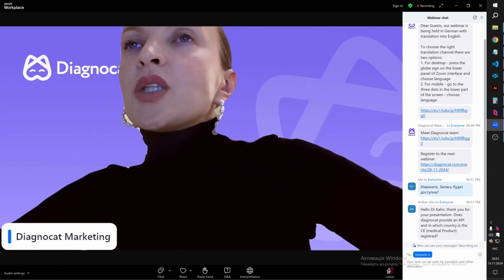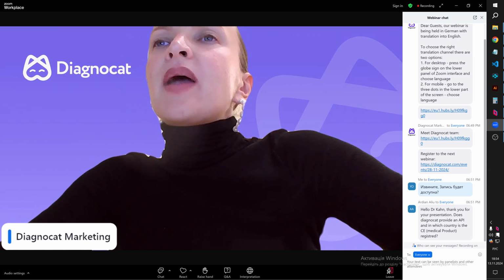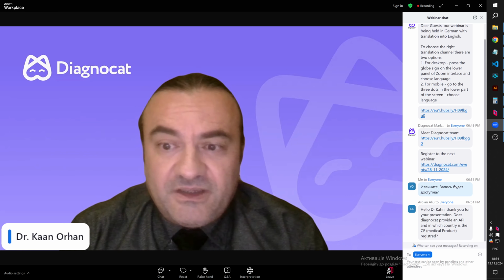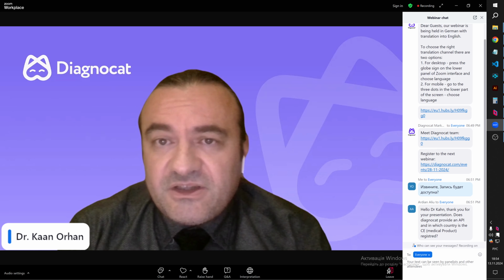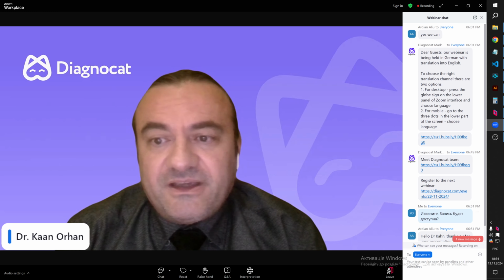No, one more question. Have we used this software to help the treatment plan with the medical history of the patient? Well, I already mentioned one case which is quite interesting, I may say. I was mentioning the CBCT segmentation, actually. And let's think about this.